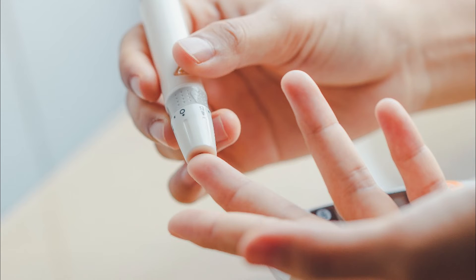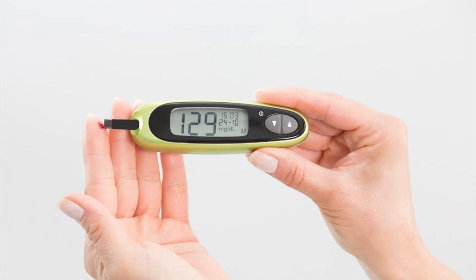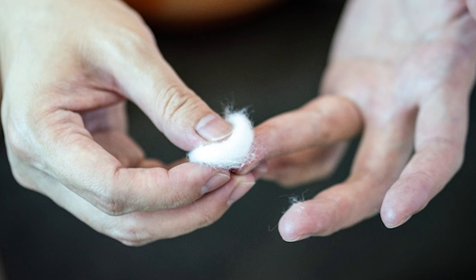Here are a couple of helpful tips. It is less painful to prick the side of your finger instead of the finger pad. Use different sites so one finger does not become too sore. Touch and hold the edge of the test strip to the drop of blood and wait for the result. Apply pressure to the pricked site for two to three minutes or until the bleeding stops.